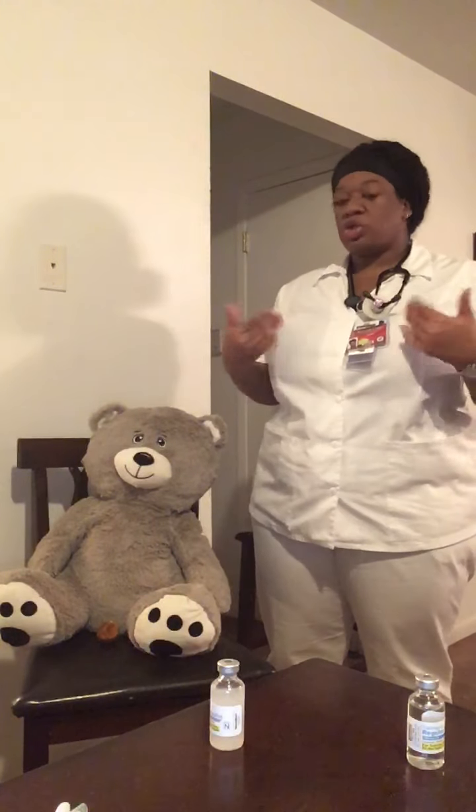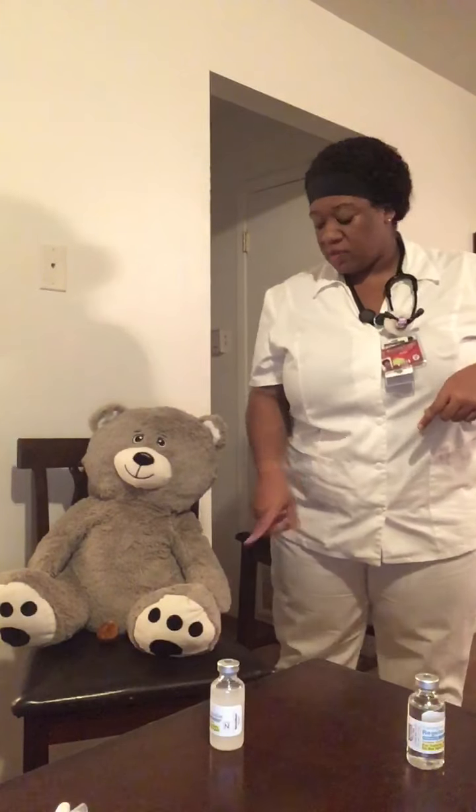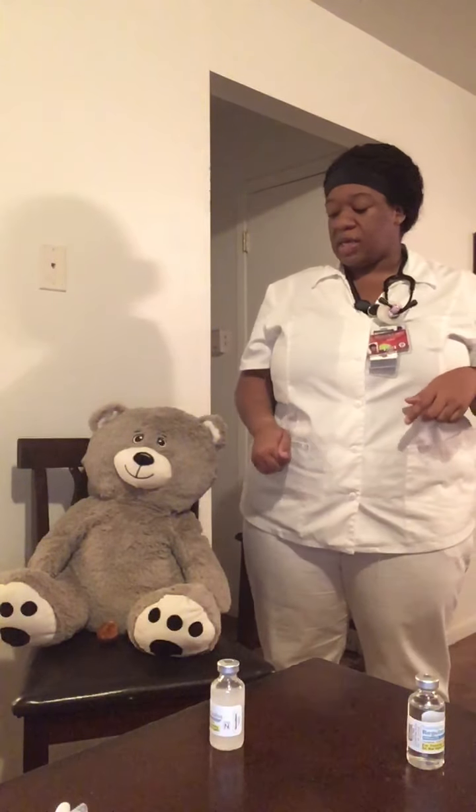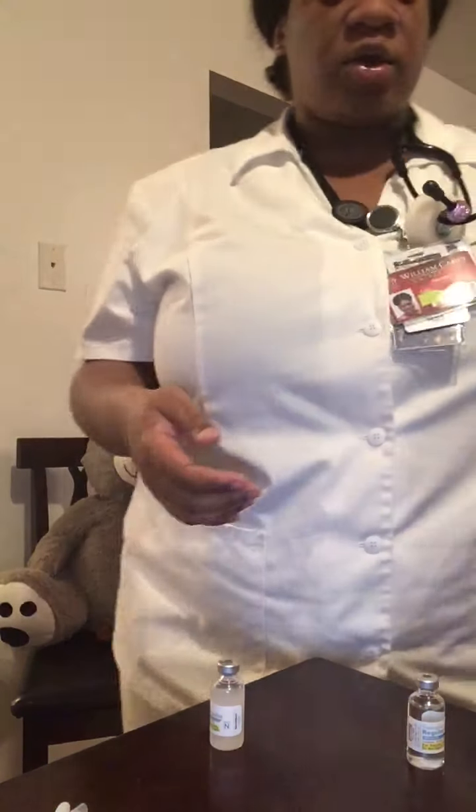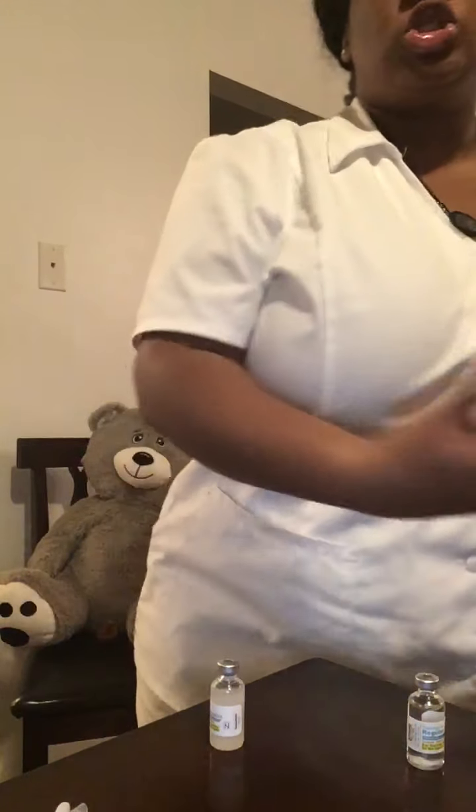I will go in, introduce myself, and ask the patient to state their name and date of birth. The patient stated their name and date of birth to me. I would perform hand hygiene and don clean gloves, and explain to the patient that I have an order to give them insulin for their past glucose reading of 252. My order reads regular insulin 6 units, NPH 16 units.